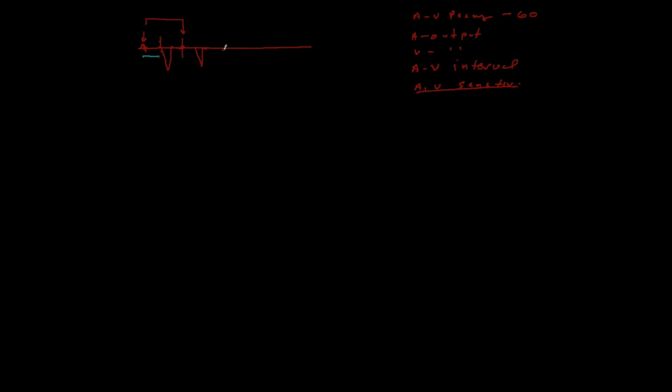this interval is exceeded. So let's say that you have a first degree AV block that resolves, but you still have sinus bradycardia. So your AV pacing here, sorry I'm kind of scrunching these intervals here, but now you're A pacing there, and actually that's conducted, and so then you go ahead and you get a native ventricular beat. And so this would be called, sorry, it's wrong, it's called A pacing and V sensing, because the ventricle doesn't need to be paced. It sensed something that was going on.